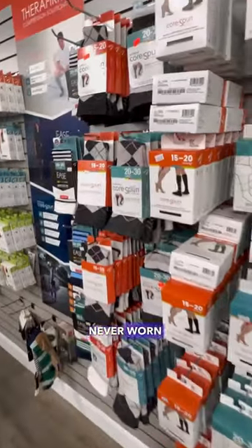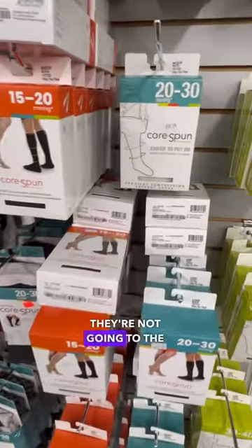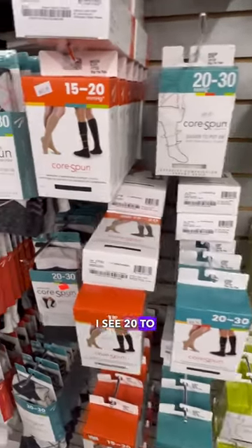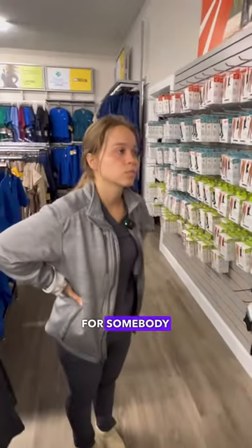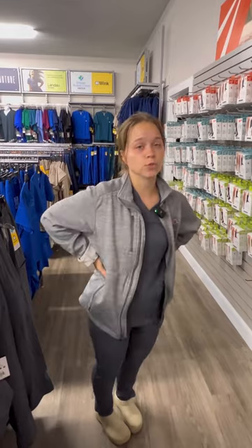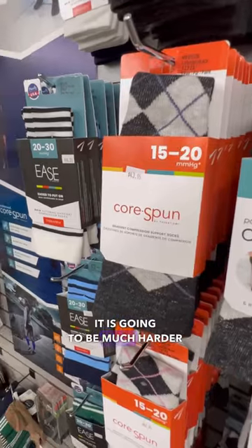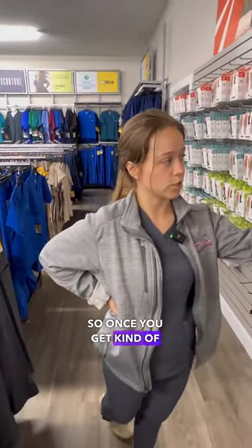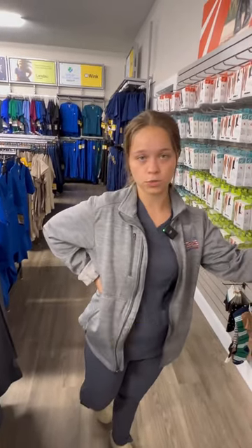So if somebody's never worn compression stockings before and they're not going to the doctor — they're just walking in off the street and they want to wear them — I see 20 to 30, 15 to 20s. What's the easiest stocking for somebody to wear? So if you've never worn compression stockings before, we do usually recommend to start off with the lightest compression, which is the 15-20. It is going to be much harder to put on than a regular sock, that's why we recommend it. So once you get kind of used to it, you can maybe level up to the 20-30.